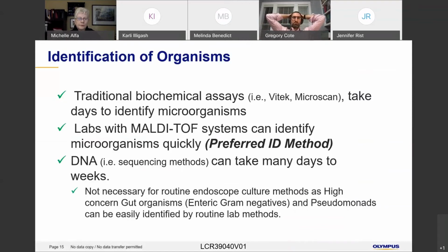So Dr. Alpha, if you can walk us through these different methods that are available for that. Yeah, historically, a lot of the larger labs actually had biochemical assay methods, micro methods that were relatively faster than the slower, archaic methods that used to be used.